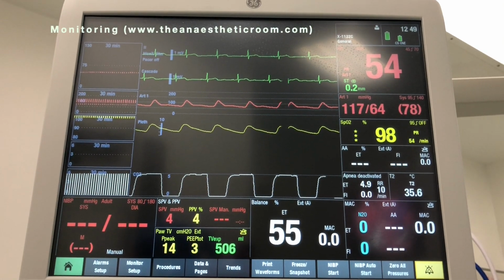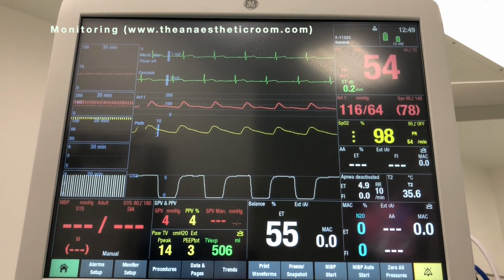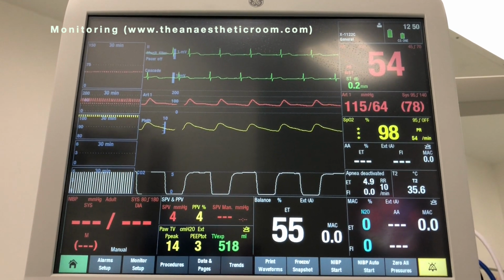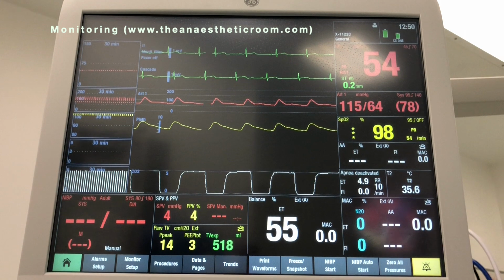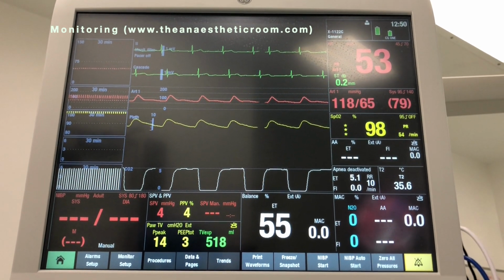This is a recording of a standard patient monitor. This is one from an anesthetic machine during a case, but the ones you see in intensive care will be variations of the same. The top green waveform is the ECG and the large number is the heart rate.